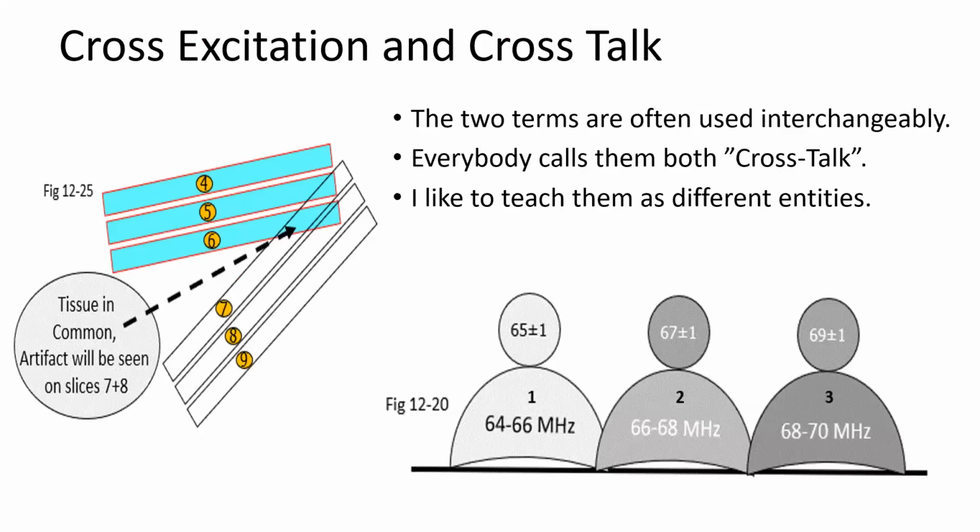Crosstalk and cross excitation. Now, almost everybody uses these two terms interchangeably. Sorry, I don't. Maybe I'm being pedantic, but I don't teach them that way. So these two terms, like I said, are interchanged. Almost everybody says crosstalk. I don't teach it that way.